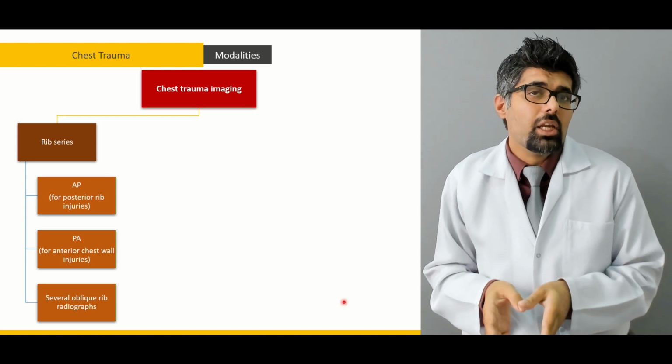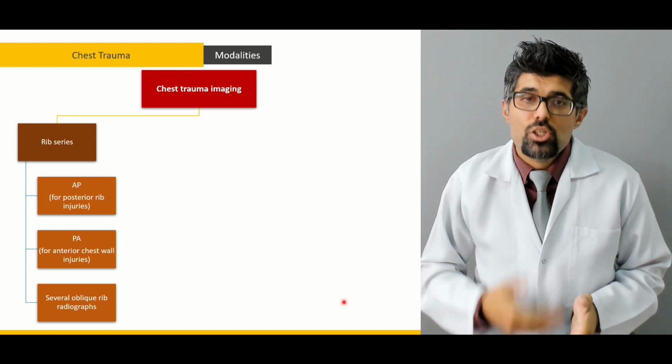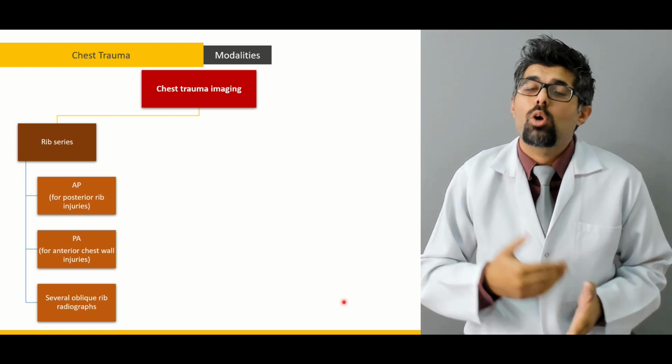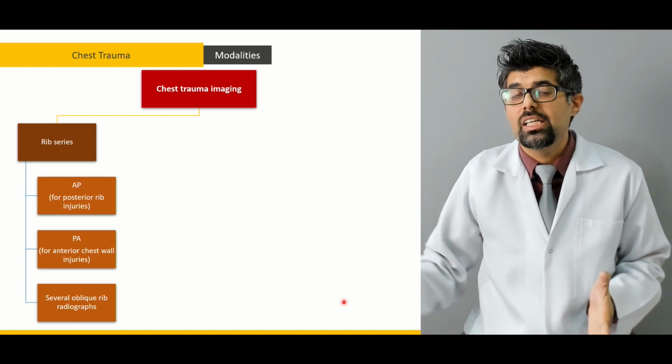The reason being, during the chest trauma, the damage is always developing. The hemorrhage, the extent of the damage, the tissue, it's always developing. So a series of chest x-rays is done.